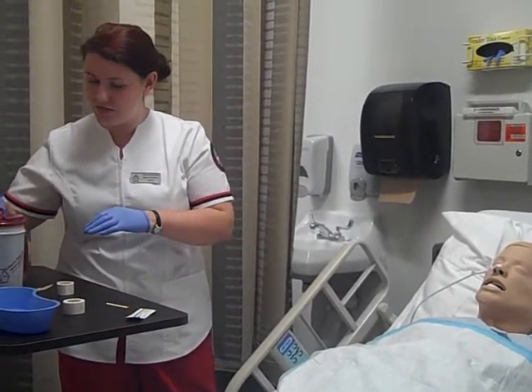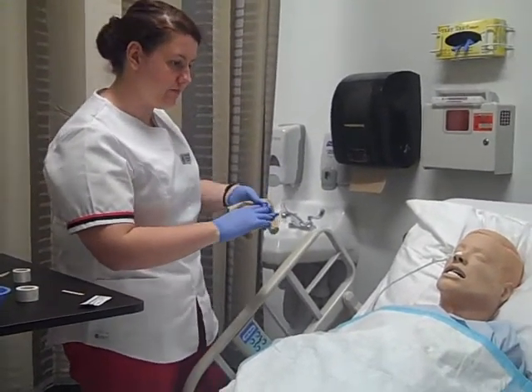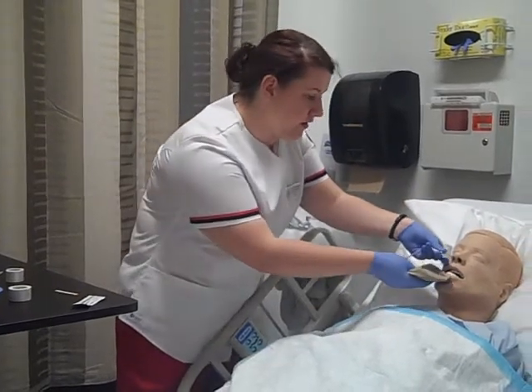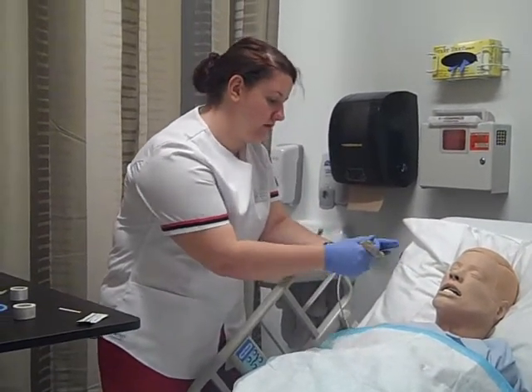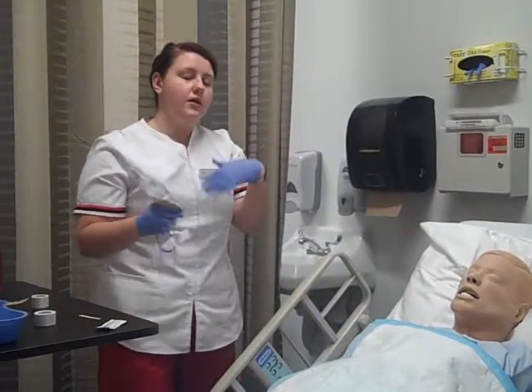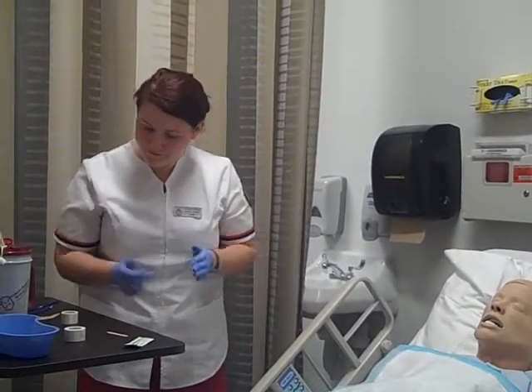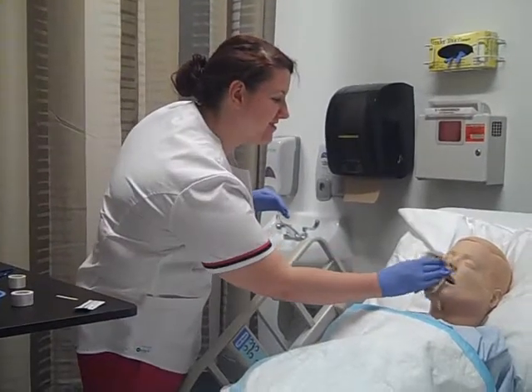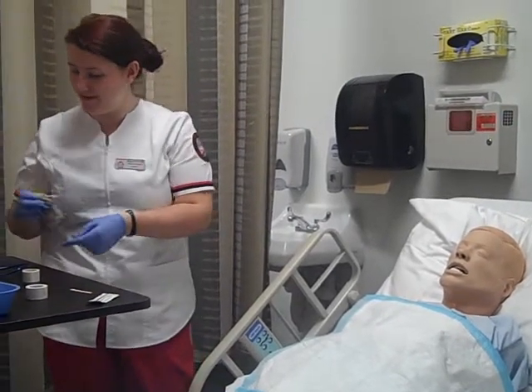Okay, Miss Amy, I'm going to begin the process of removing your NG tube. I'm going to remove the tape, and when I do it, I need you to hold your breath for me, okay? So I'm going to remove it — hold your breath for me. Hold it, hold it, hold it. Good job, Miss Amy. Thank you. And now I'm going to remove it from your gown too. In real life, I would put the NG tube in a biohazardous bag, but since we don't have that today, I'm just going to set it aside. Okay, Miss Amy, let me just clean your nose for you. Would you like a warm washcloth today? No? Okay, you're totally fine.